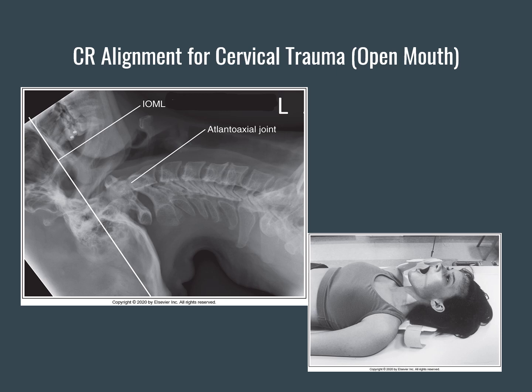So in this position, the line connecting the incisors and the mastoid tip is at approximately a 10-degree caudal angulation, and the upper incisors are at an angle with a central ray that will result in less magnification of them because of the foreshortening of the resulting projection.